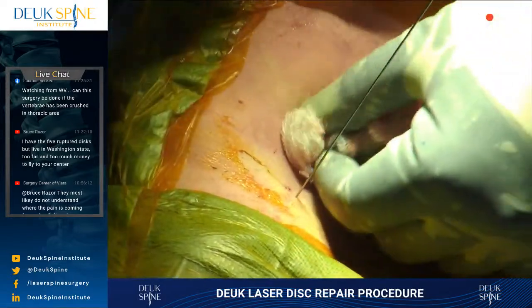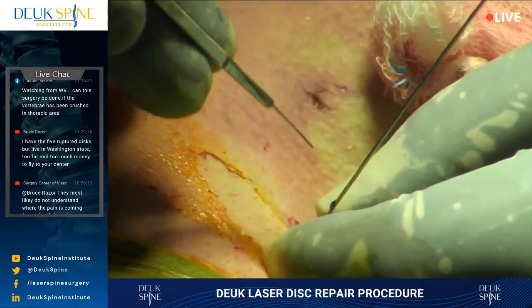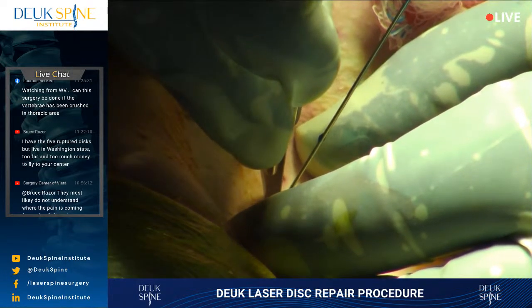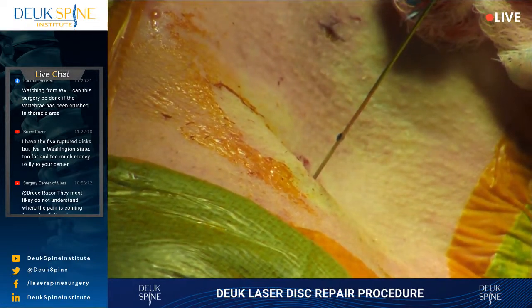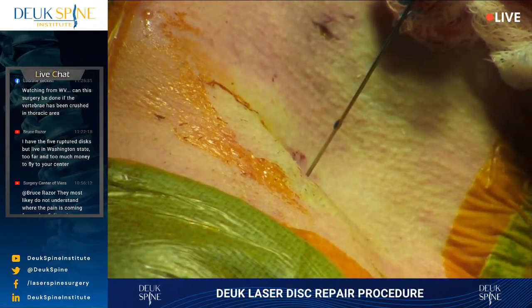So we're doing all this with 2 little pokes. It's going to look like a vampire with a bad dentist bit this patient's neck. But that's it. And those little holes are going to heal themselves, repair themselves, usually within a few days. The skin is healed in 3 days and the patient is back to normal. Can't get that with a fusion.